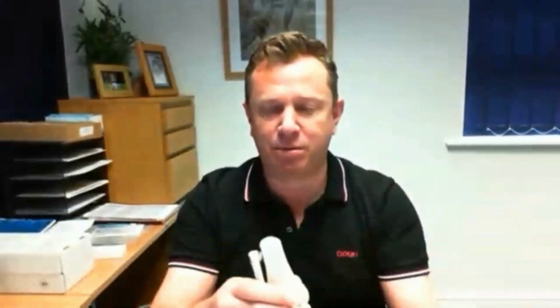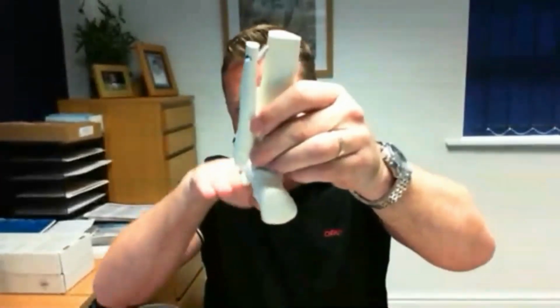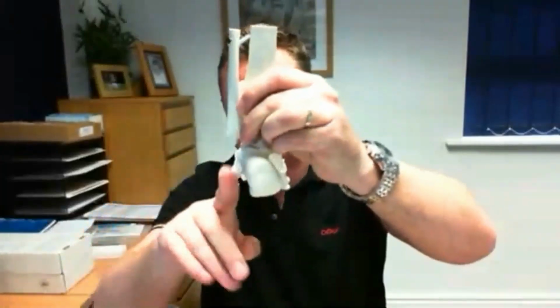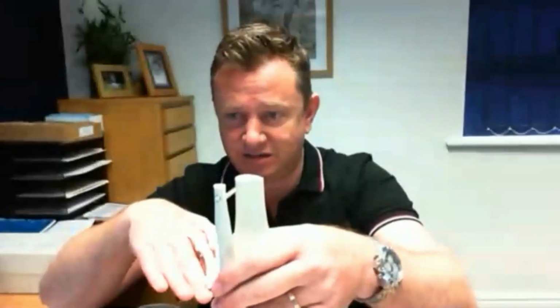So, for example, one of the traditional tests for a supinated foot in musculoskeletal healthcare is the Coleman block test. You apply a block laterally, load the foot, and that lateral forefoot wedge will change the hindfoot alignment. If we have feet which are supinating as the result of weak peronei, we need to replace the function of the peronei. The peronei's job is to evert the forefoot by acting on the midfoot. We need to be laterally wedging these devices.